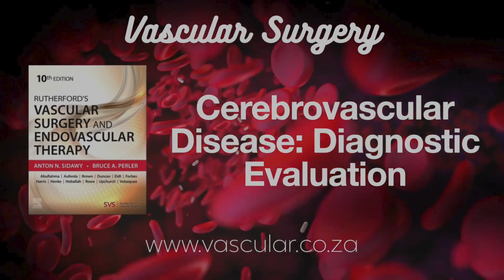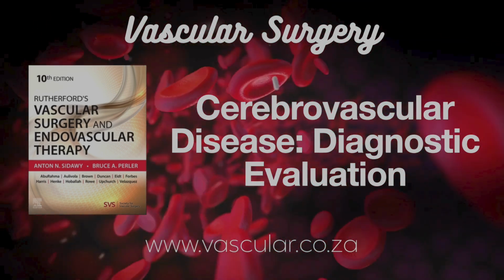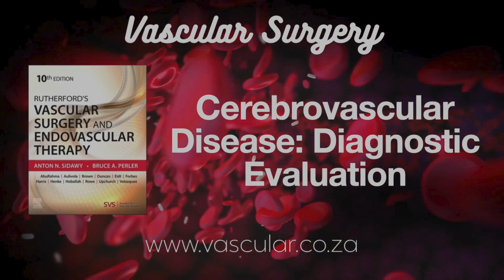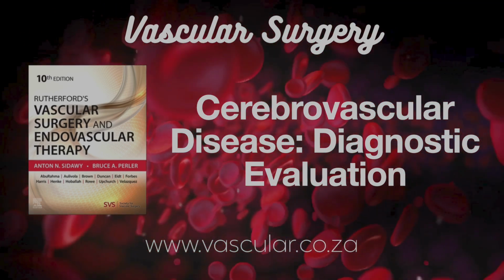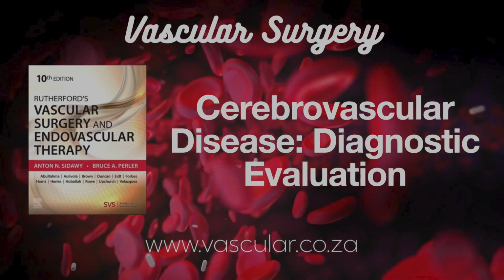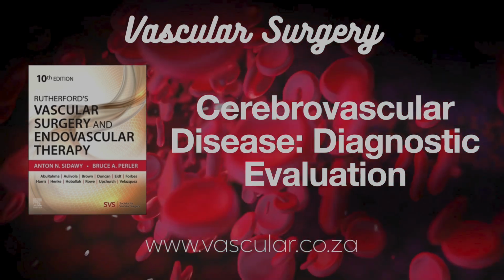But for those asymptomatic patients in the 50–69% DU range, or if the DU seems unreliable in a symptomatic patient, then getting a secondary study, usually a CTA, is common practice to confirm the stenosis and check the surrounding anatomy before surgery. Makes sense. What about the endovascular option, stenting, either CAS or TCAR?